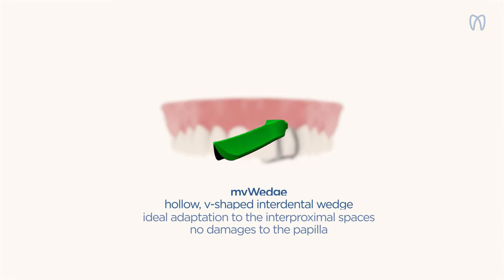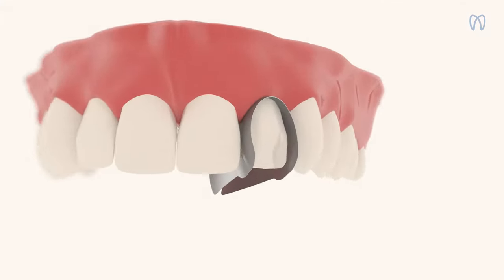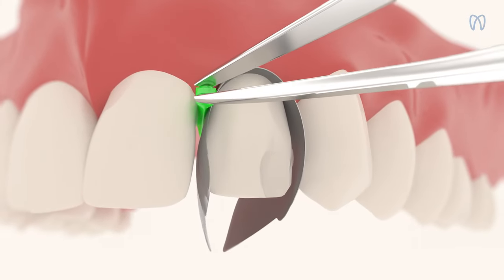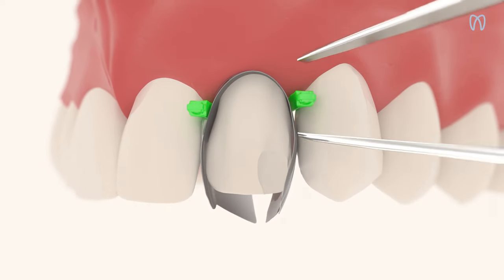The system features MyWedge, the hollow V-shaped interdental wedges that, when inserted, adapt to the interproximal spaces without damaging the papilla. Secure the matrices in place with MyWedge.